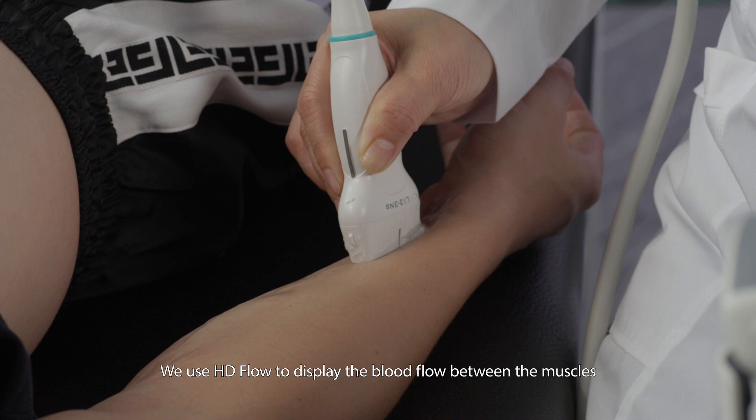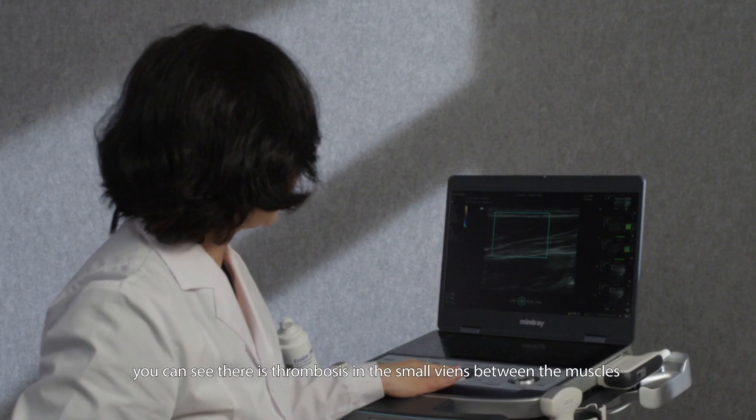We use HD flow to display the blood flow between the muscles. You can see there is thrombosis in the small veins between the muscles.